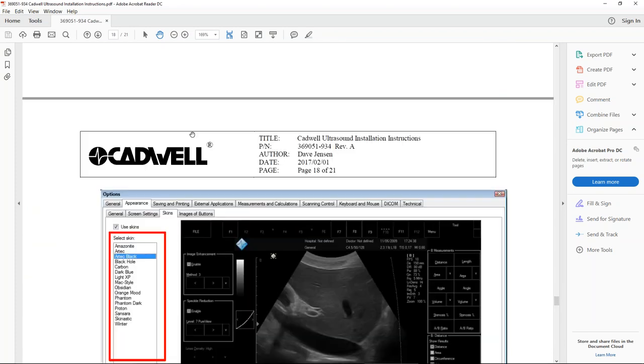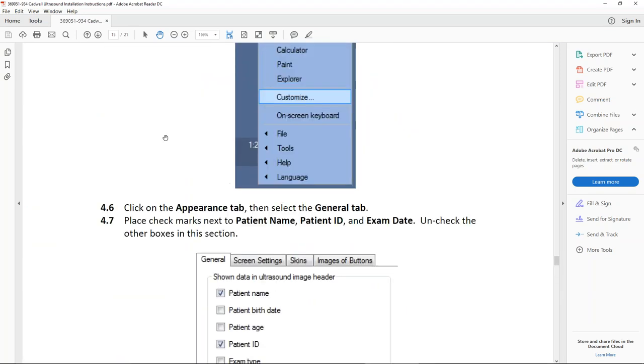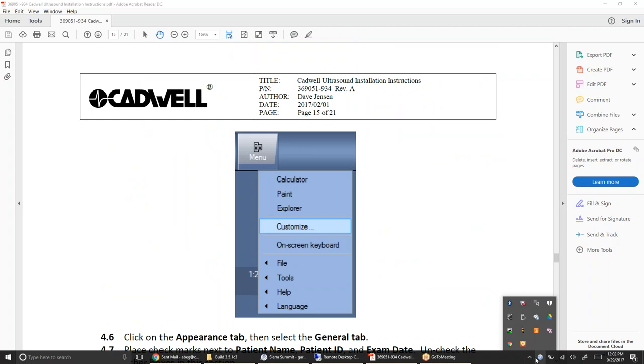There are a few other things in the installer instructions. Basically, it's just walking through how to configure the ultrasound software and a couple of things in Windows — basically just opening it up so when you have the installer installed, you can see it on your toolbar.